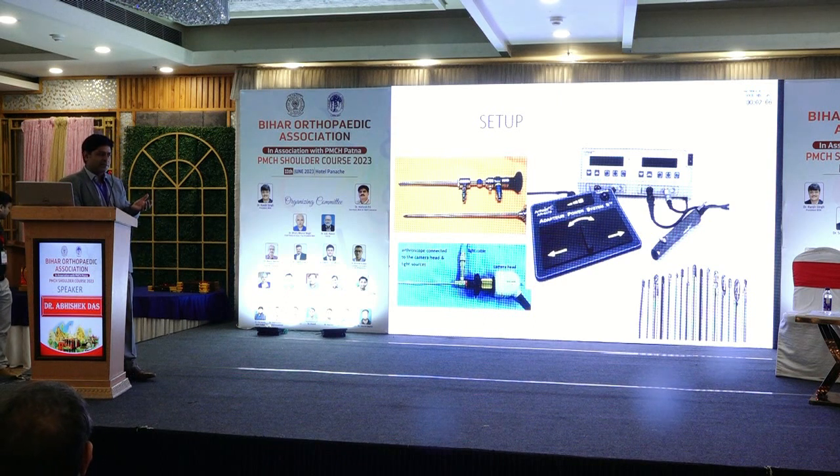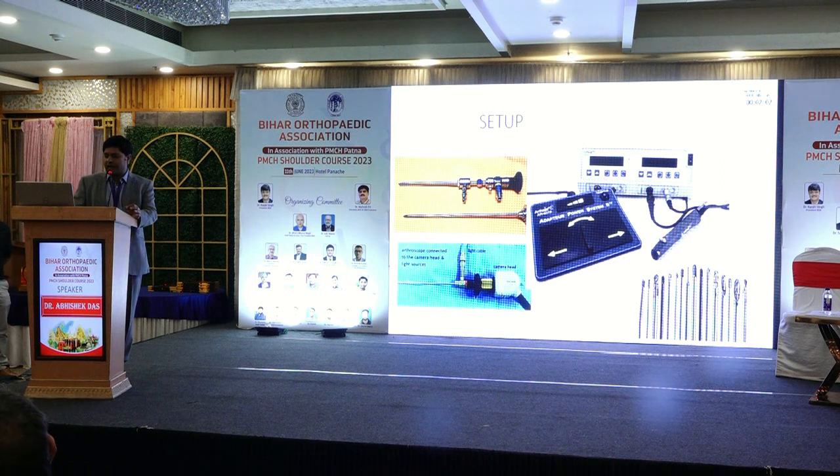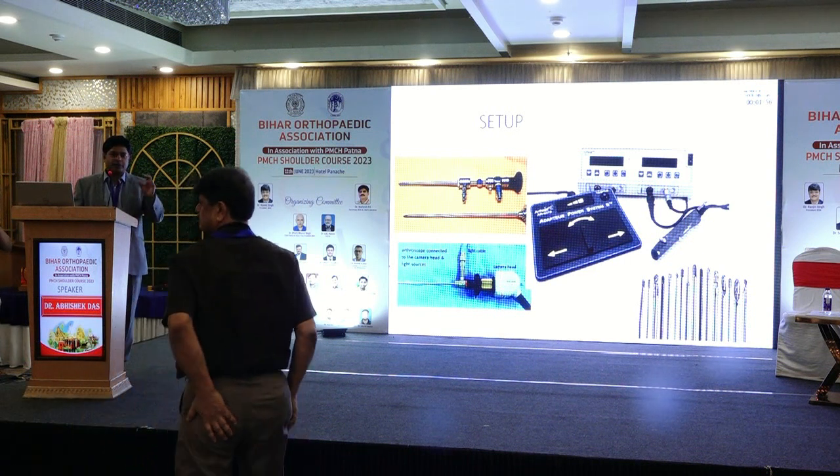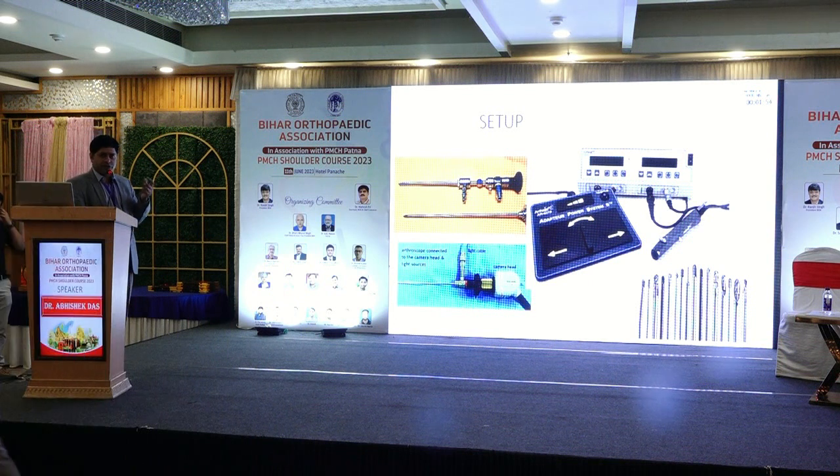So invest a little bit in it so that your handpiece is a bit light, and it has both the options of operating it with a foot switch or operating it with the switch on the handpiece itself. Because sometimes you have too many things in the hand, then you want your foot to work for you and you can press the pedal. You cannot rely on somebody else to press the pedal for you.